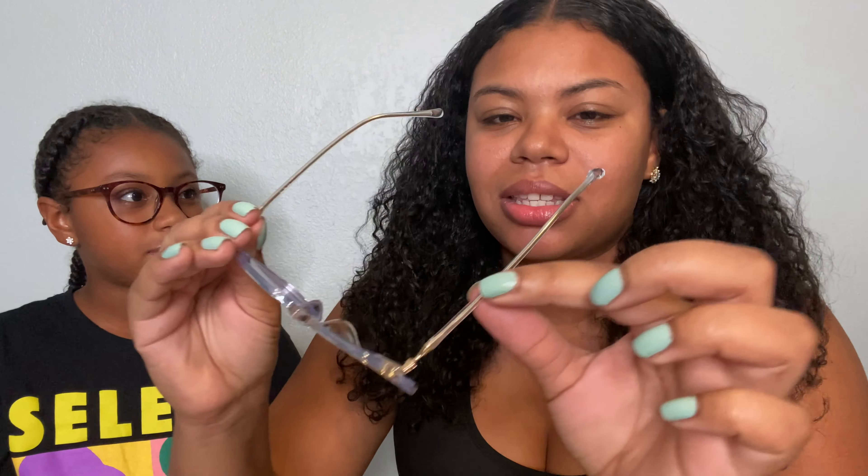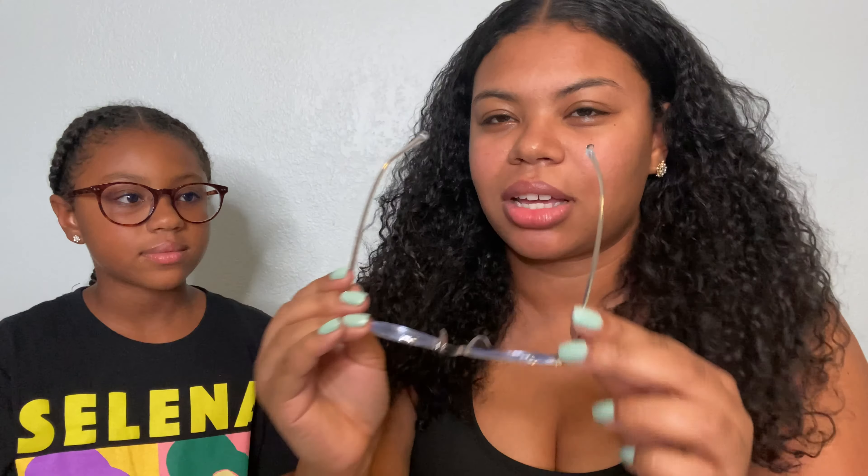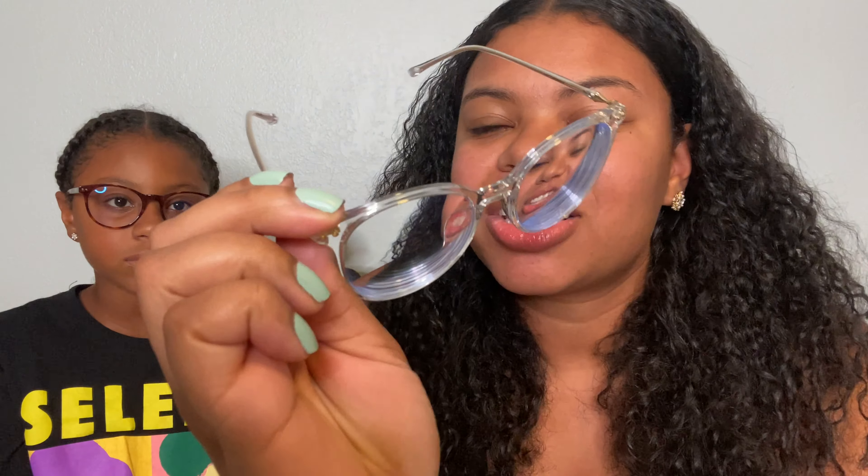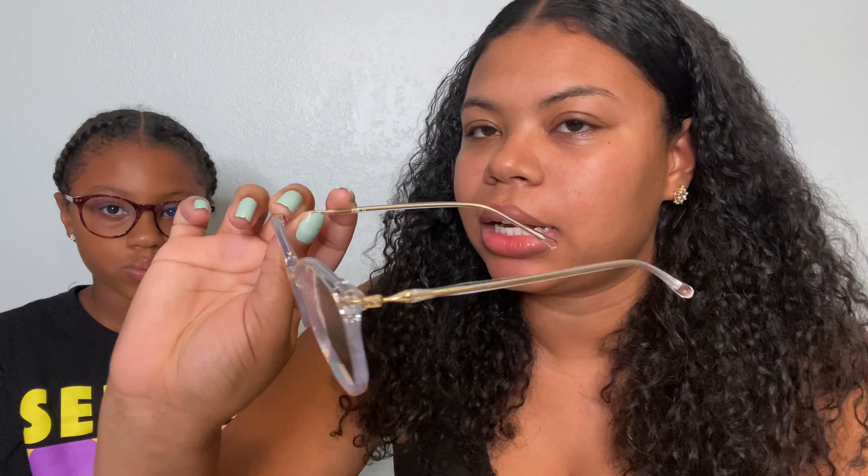It does fit perfectly on my ear. Mine isn't like a hook so they may slide a little, but they are in place because of the texture here — it just works, it's not slippery. I really love these. I think I got the high index because these are supposed to be way thicker otherwise. I didn't get the highest index but I definitely got some index with my glasses, along with the blue light, and Kenya as well. My frames are size large and Kenya's is size small.